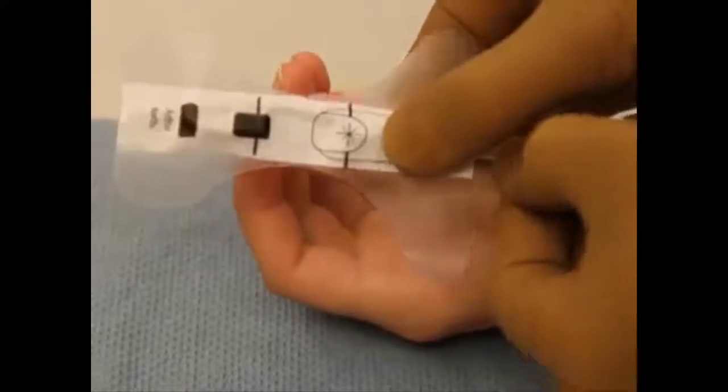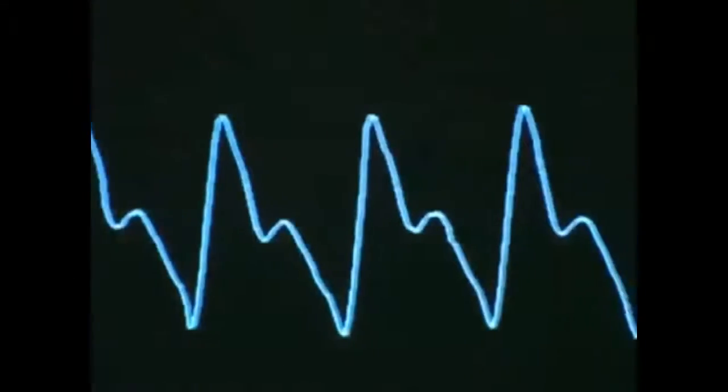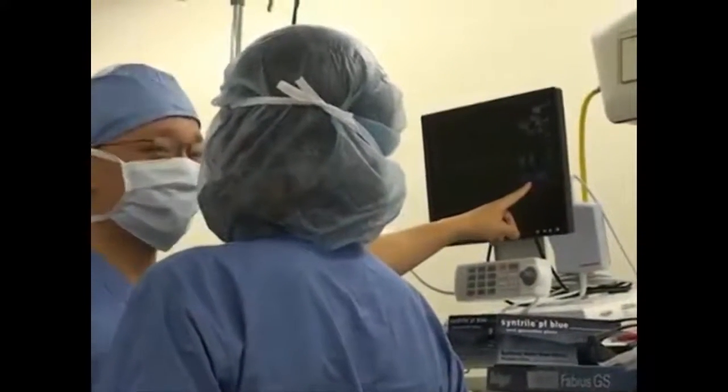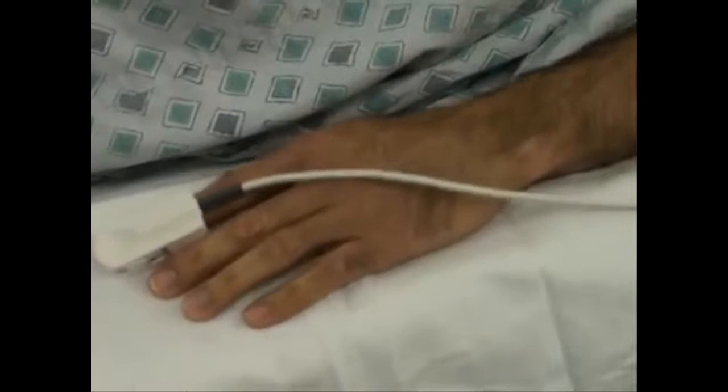This video demonstrates the equipment needed and how to use it. It also addresses the common applications of pulse oximetry, explains how to interpret the data generated, and presents its limitations as well as common problems encountered with its use.